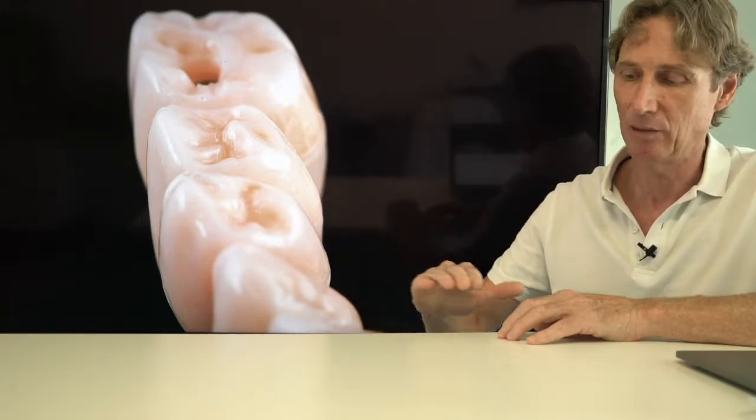Years ago I explained this procedure with a Lego construction. So we have the first Lego is our baseline, the combination of the implant and the multi-unit. The next Lego brick is our PEEK framework. We can have 1 brick, 2 bricks, 3 bricks, 4 bricks, depends on the volume of the bridge. No, absolutely no problem. And then we have 1 layer, and that's our veneering, and we do this in the SIEWERT bridge with ceramic material. So here in the individual cut-back design of these single crowns, the technician is absolutely artistically free of doing the shape he prefers.